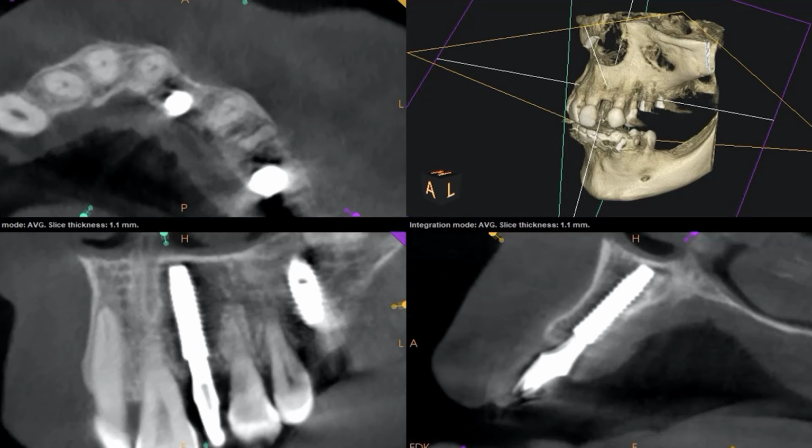I know that for a couple of reasons. Number one, I was in there. Visually, I detected it. I could tell there was more bone than I see on the x-ray. And number two, I've just worked with a lot of implants and CTs and know that you always get a little bit of deficient-looking bone around that metal. And so I know that there's a little bit more bone there.